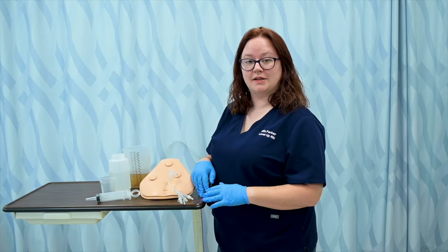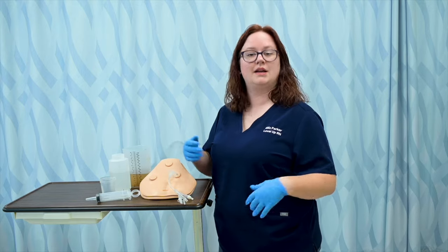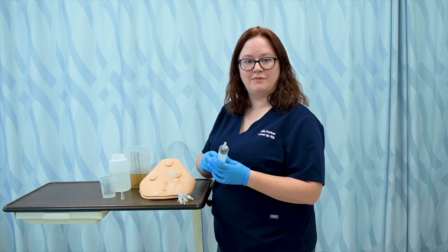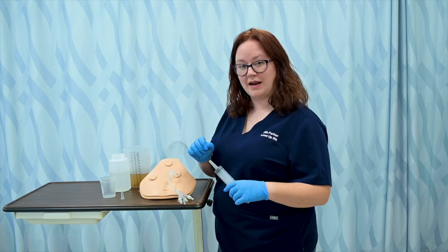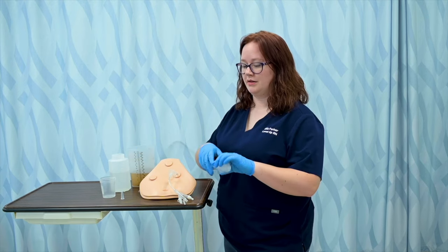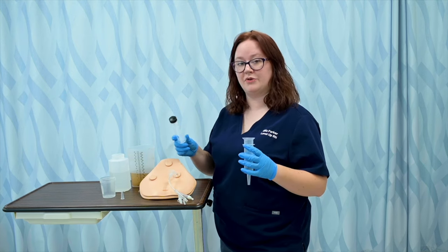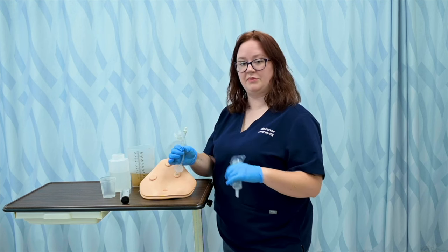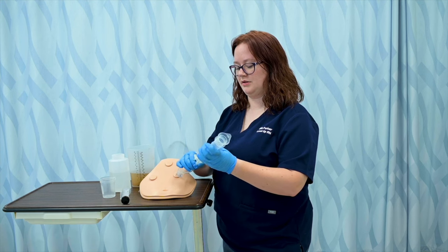Doing an open system — we might call it a gravity feed or a syringe feed — means I'm not using a pump or a bag; I'll use a piston syringe. Just like with the closed feed, I may check for GRV and bowel sounds and things like that. When I'm ready to administer my feed, I'll make sure the container is open and I've got a piston syringe. I'm going to do it via gravity — I simply pinch my tube, remove the stopper, and insert my syringe.